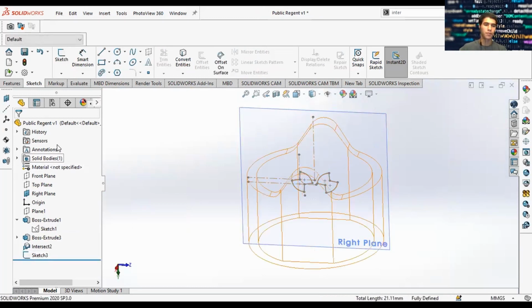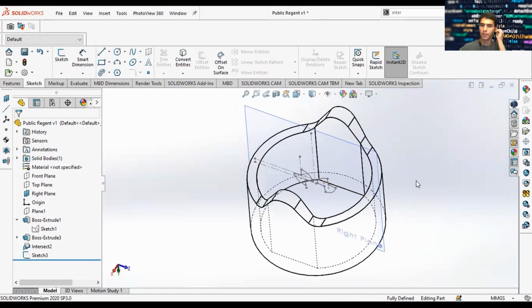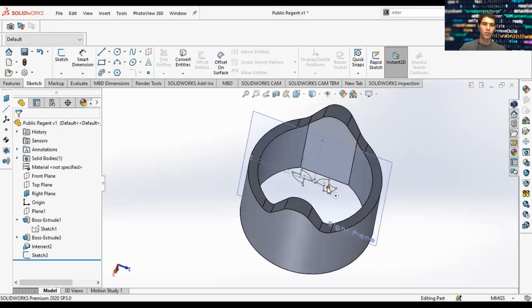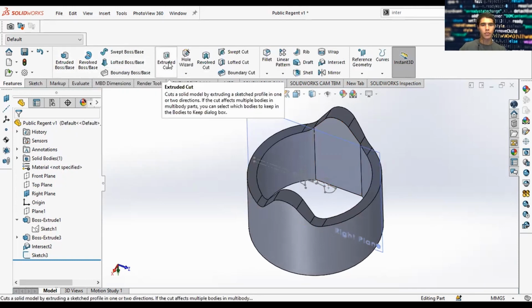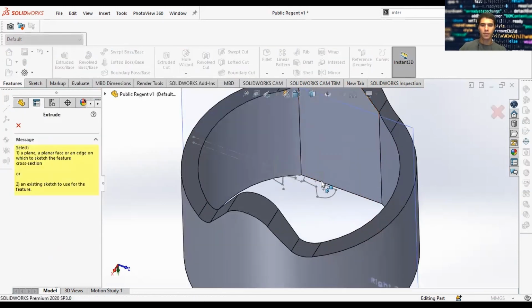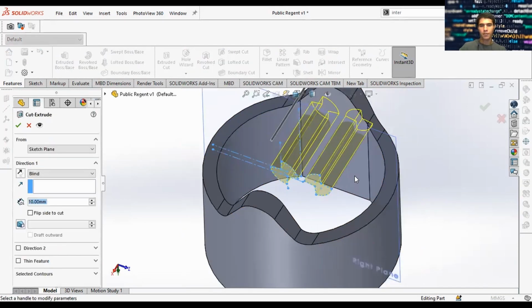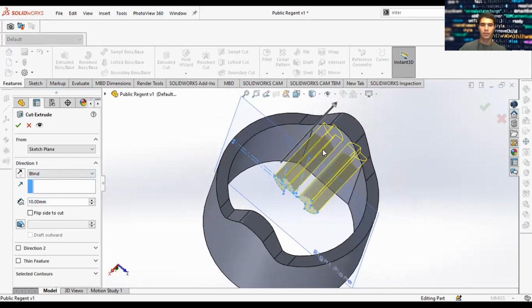Bring back our body. And you can see right now our body. So now what you have to do is you already made your hinges for your pivot. Let's extrude them. Go features, extrude cut. In this case, since you have your flat face over here, you can just extrude blind.